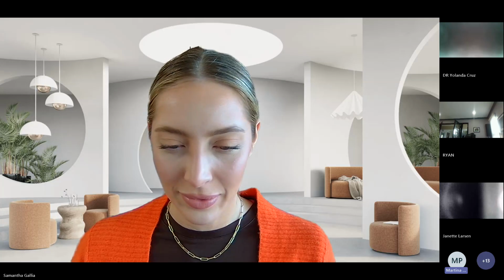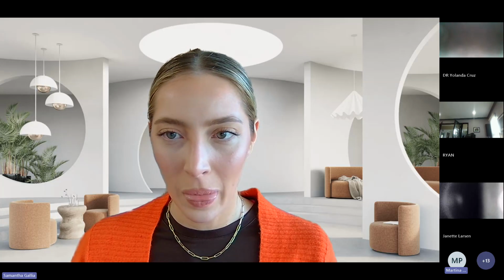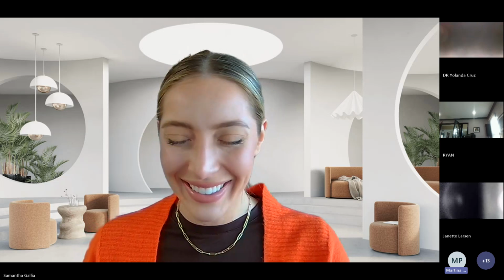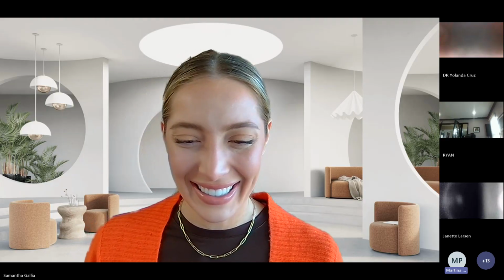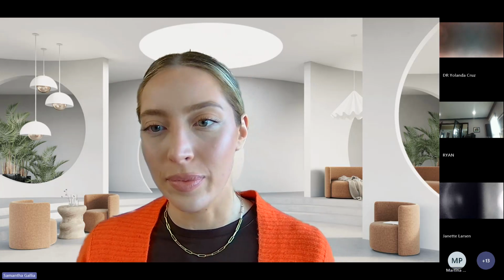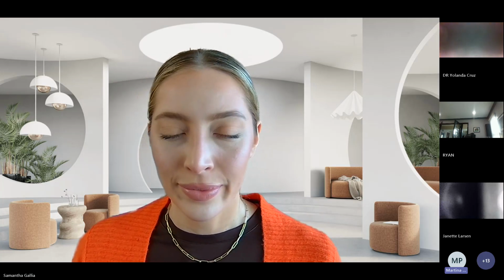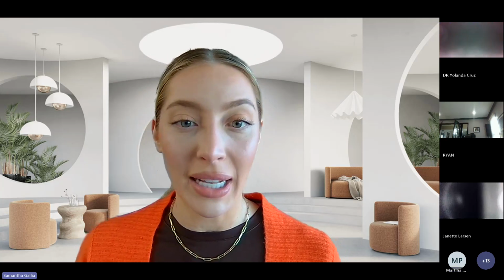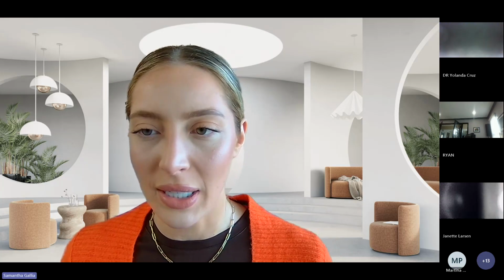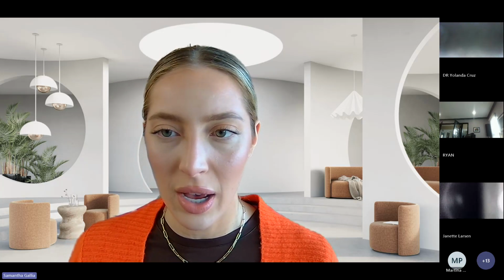So we had one that actually is going to bridge right into the DTX software about identifying the IAC, which I love that they're calling it the canal. They paid attention to the radiologist verbiage, but they're asking for what system and which view do you like to start with? And then do you double check from another area? Awesome. I love it. And that's just about the IAC. Correct. Okay. Fantastic question. We'll definitely go into that.